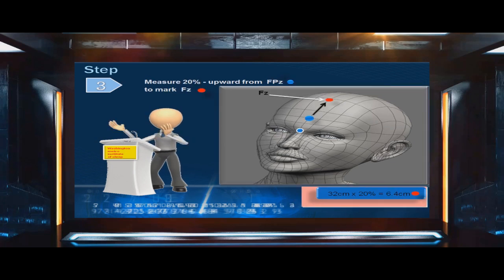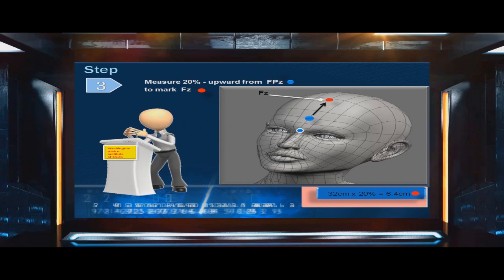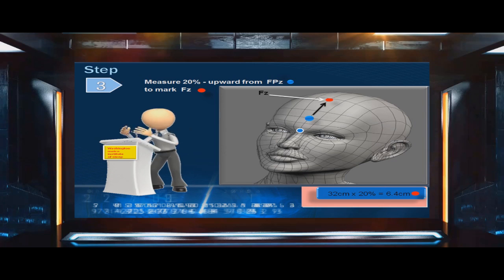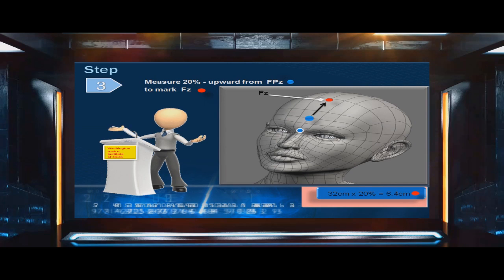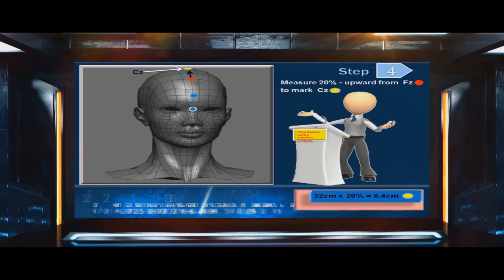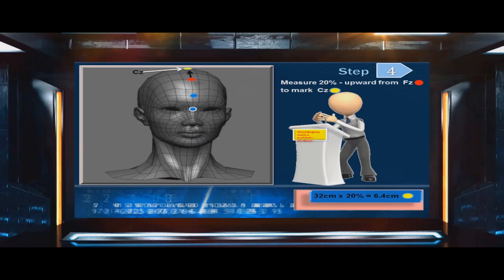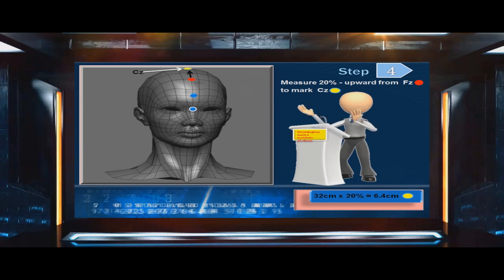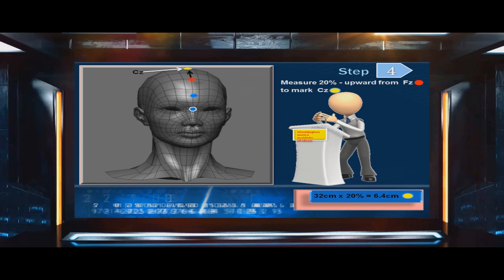Step 3: Measure 20% upward from FPZ to mark FZ. In this example, 32 centimeters times 20% equals 6.4 centimeters. Step 4: Measure 20% upward from FZ to mark CZ. In this example, 32 centimeters times 20% equals 6.4 centimeters.